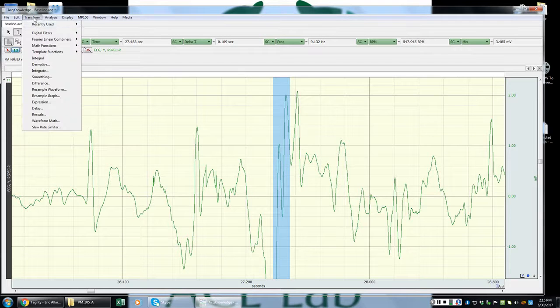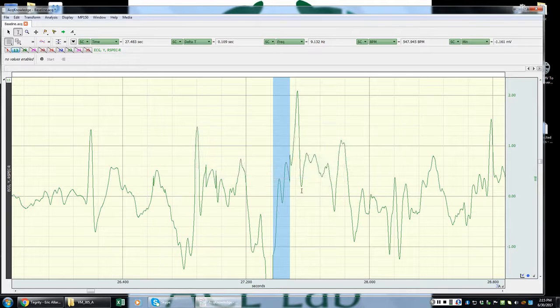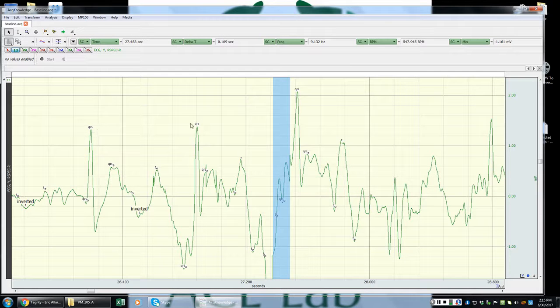So go to Transform, Waveform Math, go back to Divide, and I might divide by, let's say 3 this time. Okay. Right, and so that brings that down considerably. All right, and so now I'm going to go back, locate my ECG complex boundaries, and notice that my QRSs are now where they should be. Okay, so that's how you do basic transformation and cleaning.